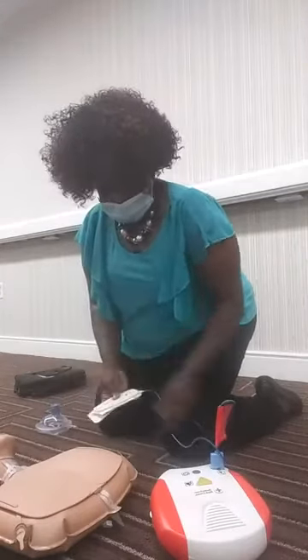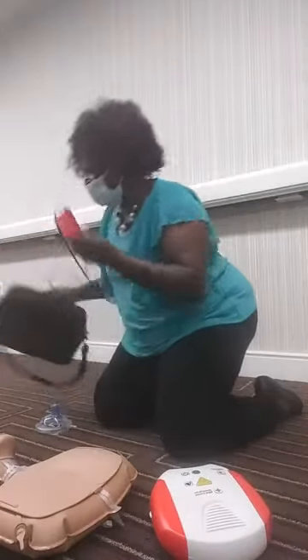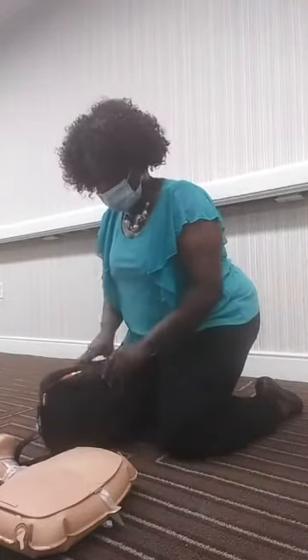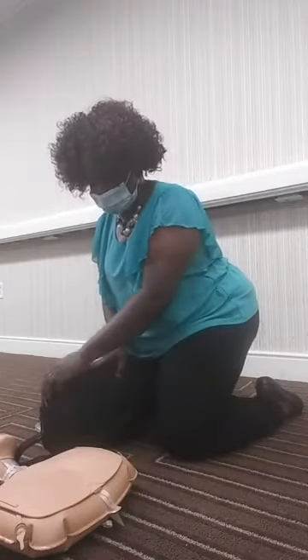Also, if the victim has any metal on, like jewelry or a necklace, or if a female has an underwire bra, you do want to remove those items because the metal can interfere with delivering the shock.